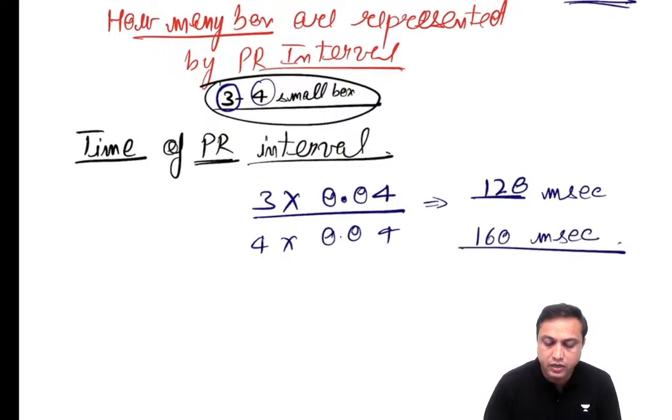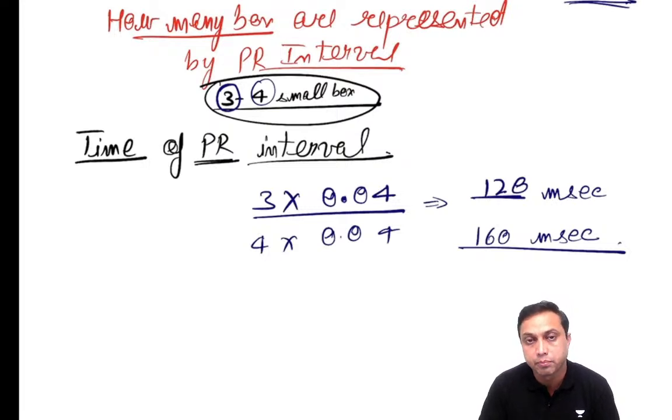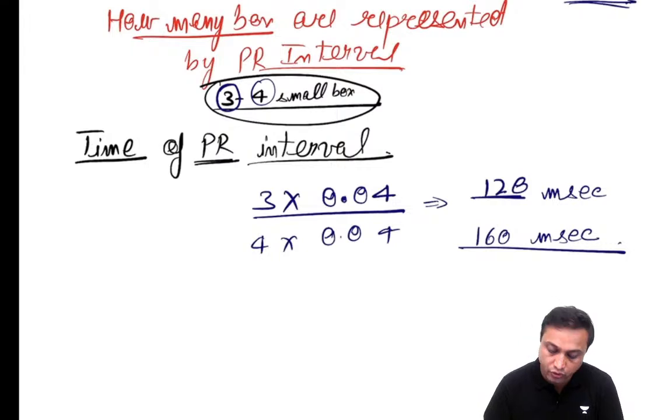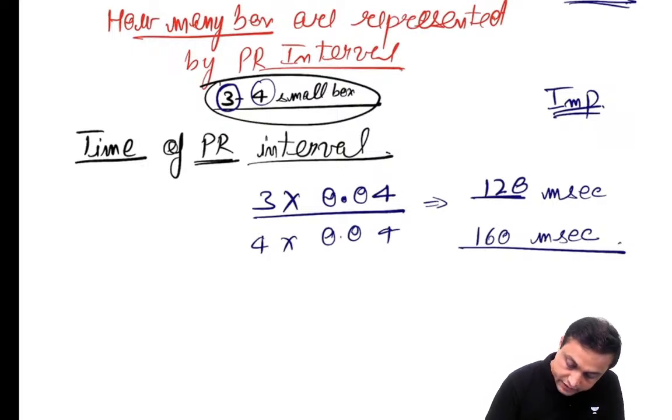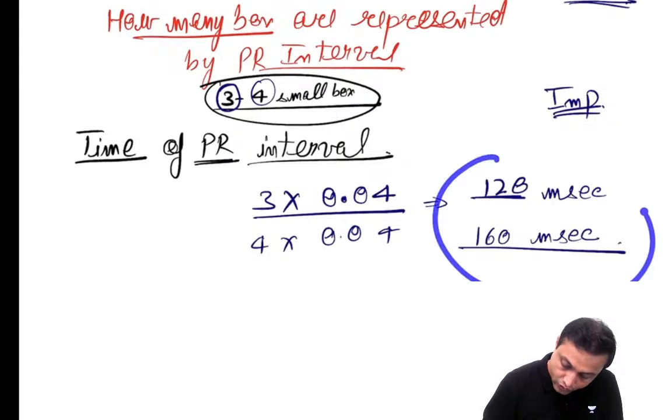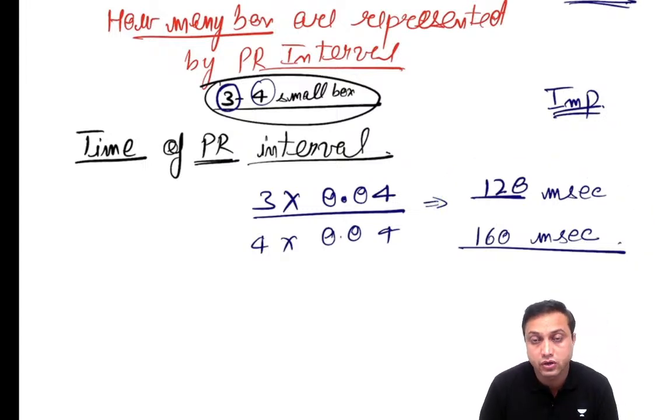So this is the normal time duration of the PR interval. Got my point? Very, very important point. So this is the time of the normal PR interval. Please guys, if something is not clear, do let me know, so that I can re-explain it to you. If not, then I can proceed further.